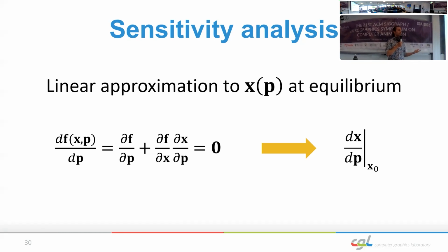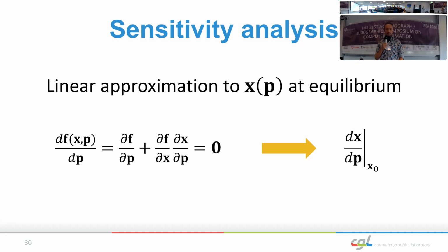And for a modest pre-computation of the sensitivity matrix, we're able to interactively generate deformed states, which can benefit doctor-patient communication by visualizing rapidly what changes in the parameters do to the facial profile.